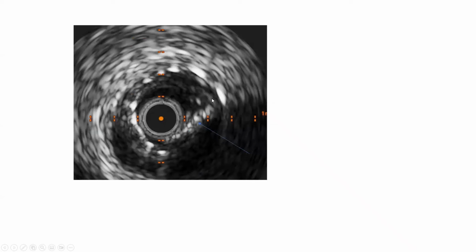And at another portion of the stent, you see really the biggest problem. This is a stent here, those bright white ones, those are the stent struts. This is neoatheroma inside it. And what you see here, this is calcium inside the stent. And you see actually a calcified nodule inside the stent. This is calcified neoatherosclerosis with a calcified nodule, likely an eruptive calcified nodule that caused the thrombus formation inside the stent.